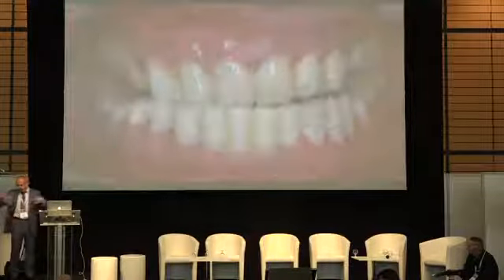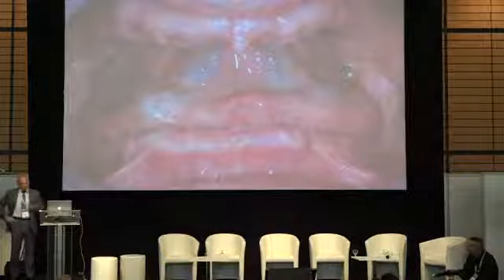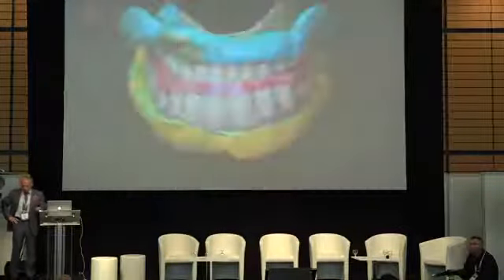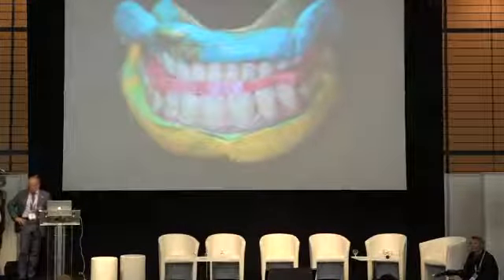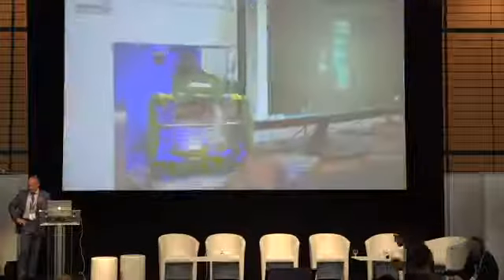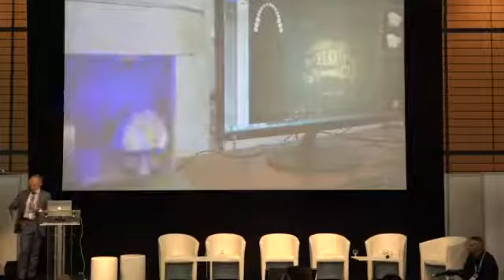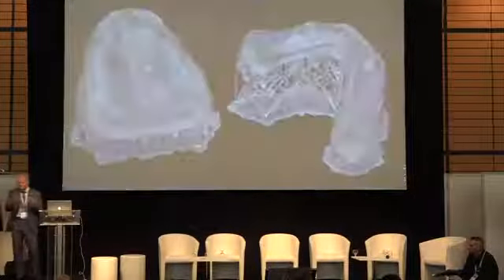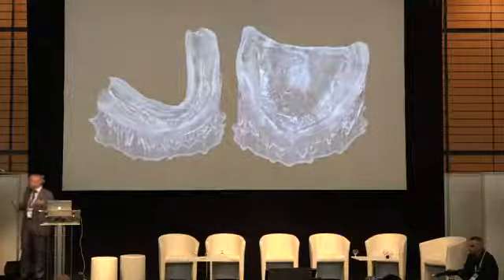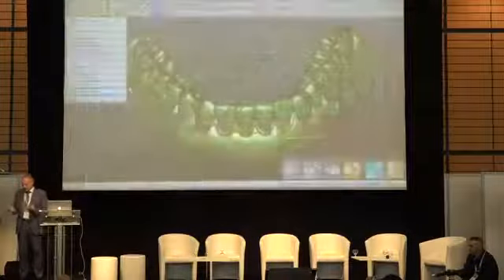Old lady with many medical issues. So for the before situation, we make examination, impressions, put the situation into an articulator, scan it. And as Uli told, it's hard to send things to Russia, so we don't send parcels, we send files.